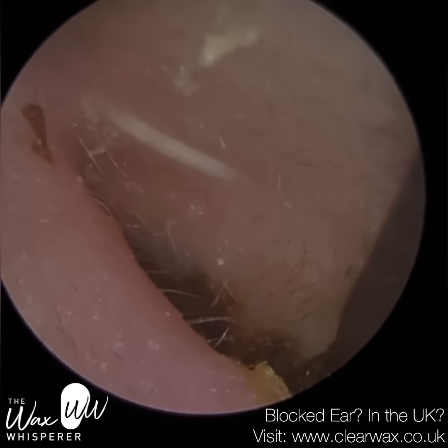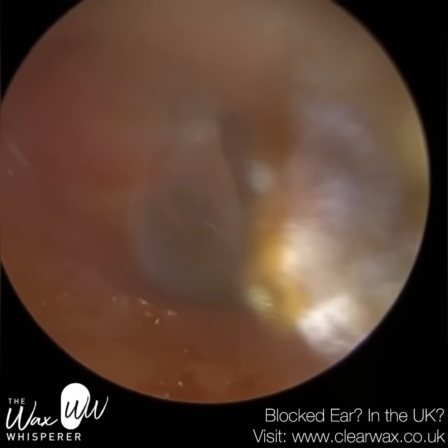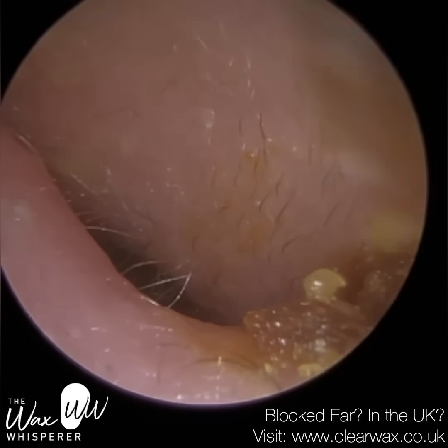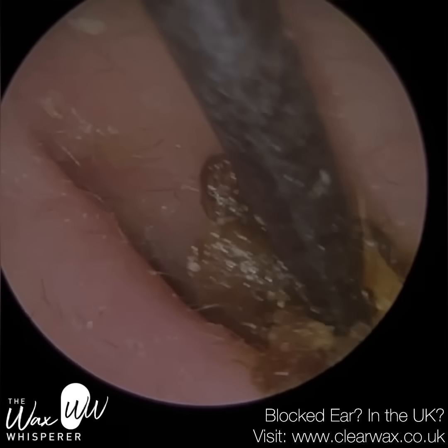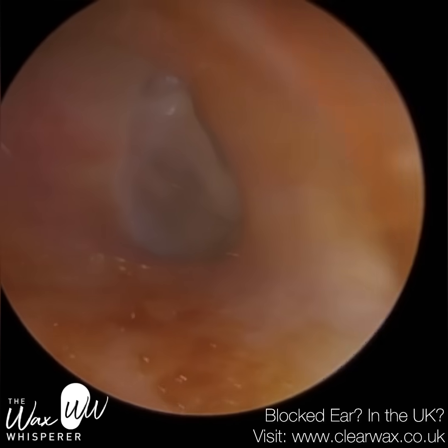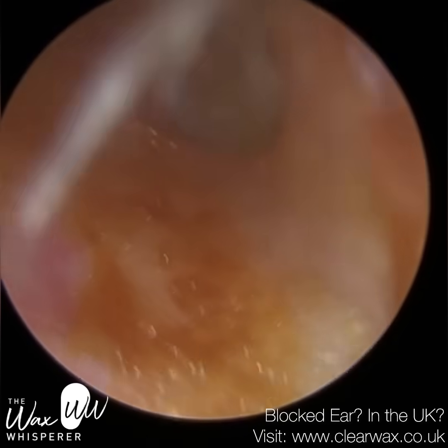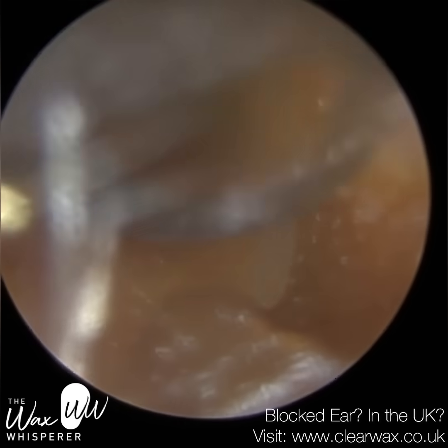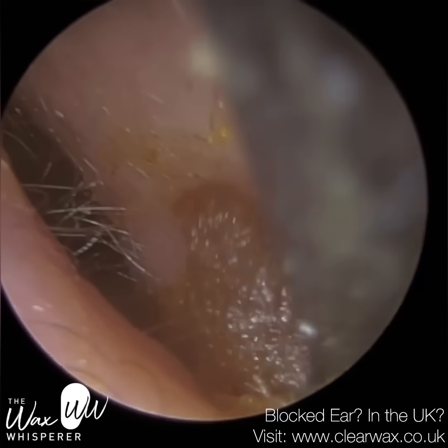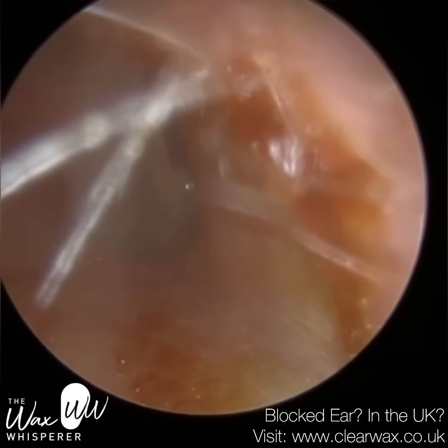Comparing this procedure to the one I performed six months ago, where I used a straight-handled Jobson Horn — and in fact a metal Jobson Horn, because the metal one is actually longer than the plastic ones we normally use. I needed the metal one last time for that extra reach, but it was extremely difficult to remove some of the wax on the canal wall, especially on the back part. With the new Rykerette bent version, it worked a treat. The patient themselves commented that this time was far quicker, and because of the metal instrument last time, even a slight bit of contact with the canal wall could be felt more. In this case, they didn't feel anything.